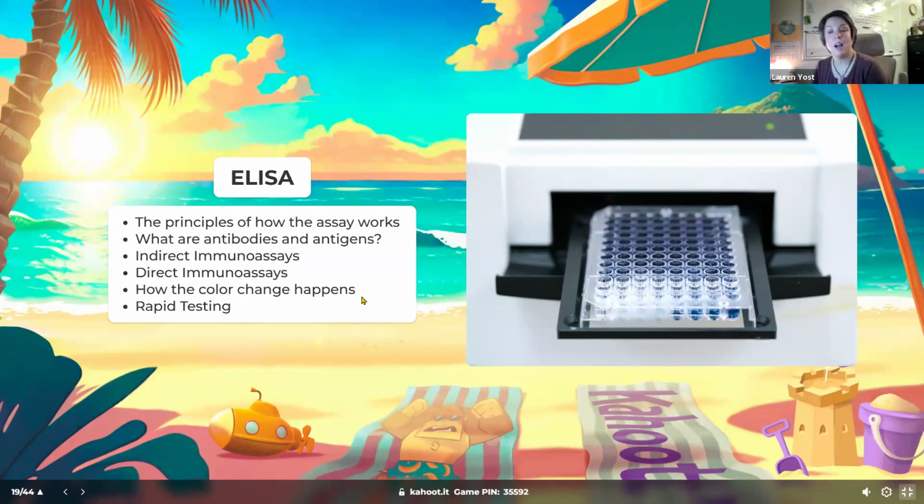And that's because the enzyme was there, because that enzyme that was linked to your secondary antibody was able to stick around because the antigen was there or the other antibody was there that you were looking for. The enzyme that was linked to it cleaves whatever your substrate is. And when it cleaves a substrate, that substrate causes a color change. It's a colorimetric change. It is measurable. How dark it is can correlate with how much antibody there was in there, for example.